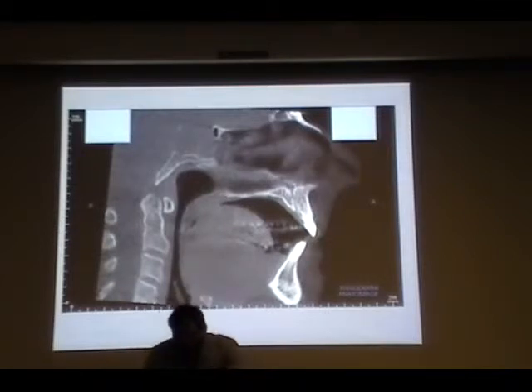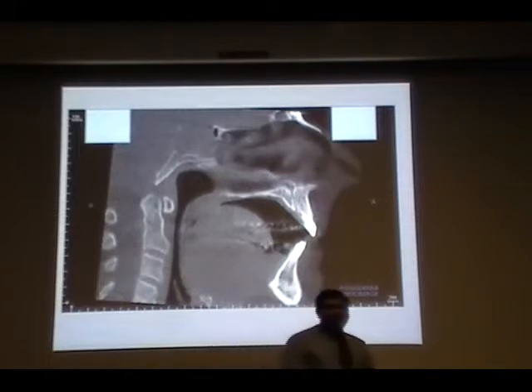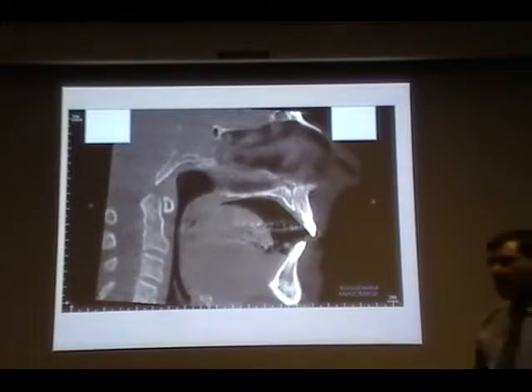Imagine you have a bread that you slice off, take a picture of that, and take a CBCT scan around it. You could miss some portion. Make sense? If not, don't worry at this point. Depending on the slice, you could capture only a few structures. Many structures may be missing.